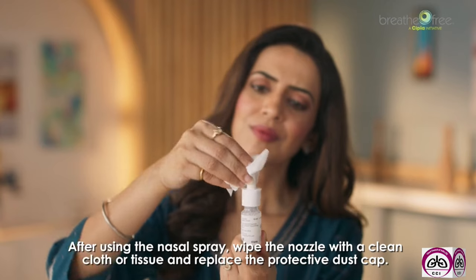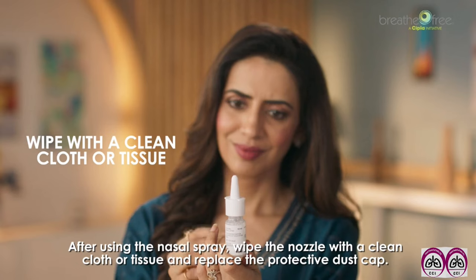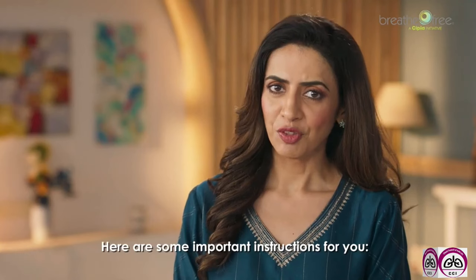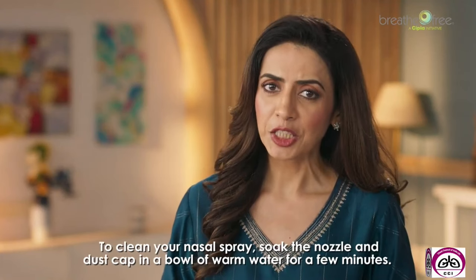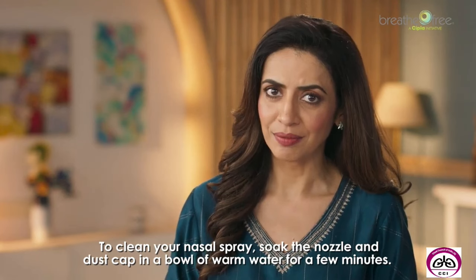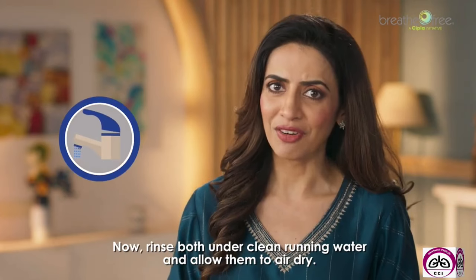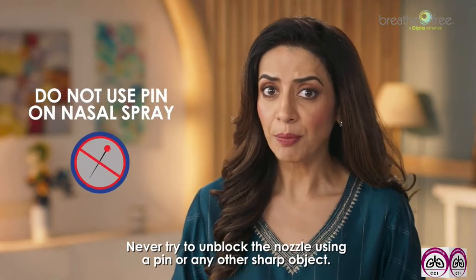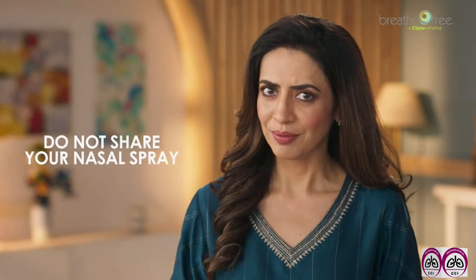After using the nasal spray, wipe the nozzle with a clean cloth or tissue and replace the protective dust cap. Here are some important instructions for you. Clean your nasal spray at least once a week. To clean your nasal spray, soak the nozzle and dust cap in a bowl of warm water for a few minutes. Now, rinse both under clean running water and allow them to air dry. Never try to unblock the nozzle using a pin or any other sharp object. Do not allow any other person to use your nasal spray.